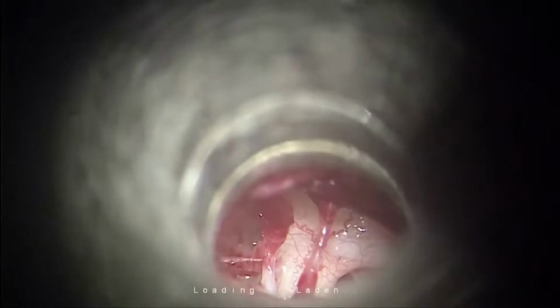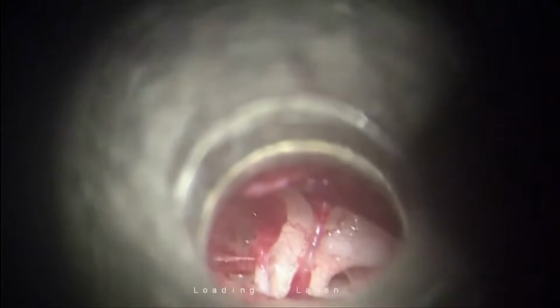Why is the laser not coming in the view? Laser. Hello, best of luck to us all. Don't worry, beta. Don't worry. Yeah, let me show you the laser beam first.